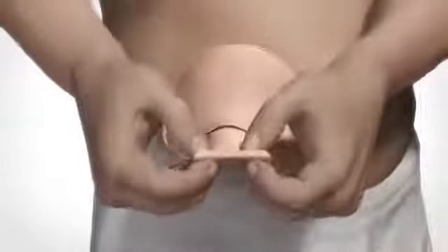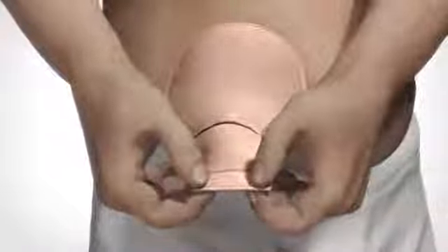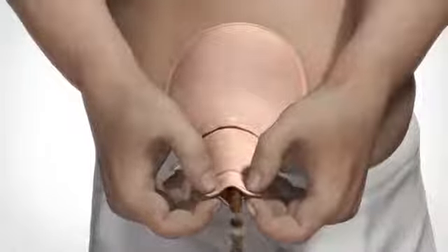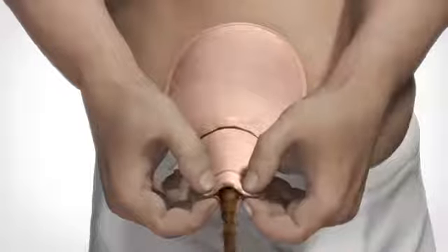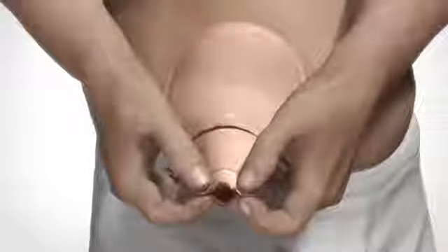When ready, empty the bag into the toilet. Point the outlet opening downwards. Bend the small plate of the outlet backwards. Take a firm hold on both sides of the outlet and slowly press your thumbs together in order to open the outlet. Allow the contents of the bag to run out while you control the emptying with your fingers.